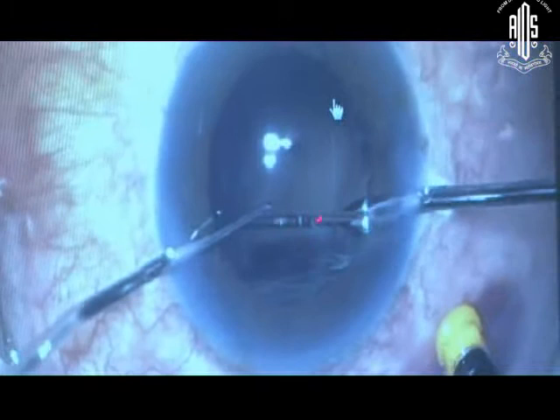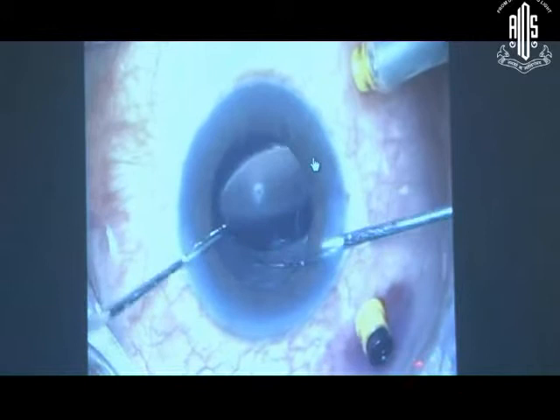This is another case where there was a nucleus drop and it was operated under scleral fixation — a rigid lens was put. But even after that the support was not adequate enough. As a second procedure, it was hanging like this. So now it is in position — how to go about it.